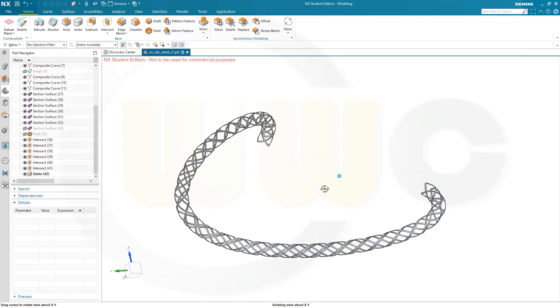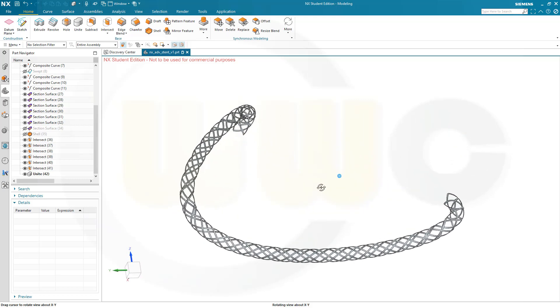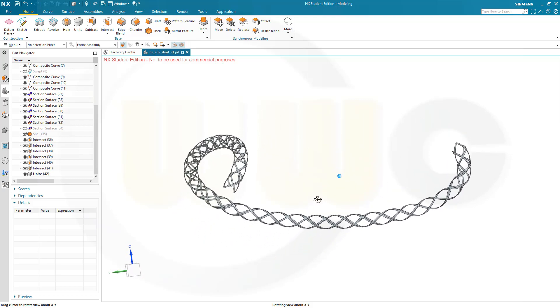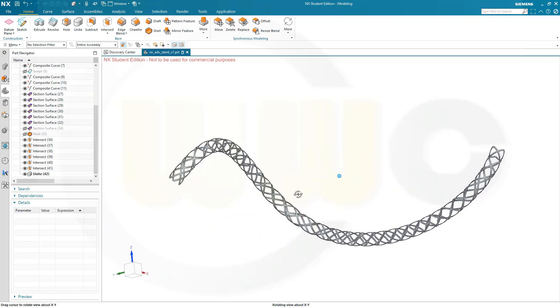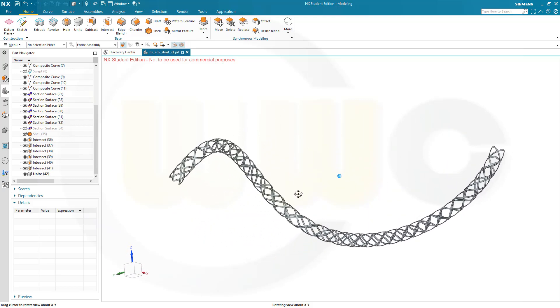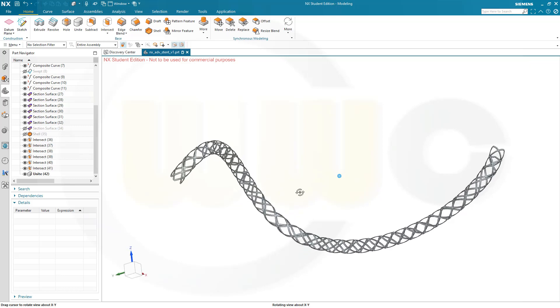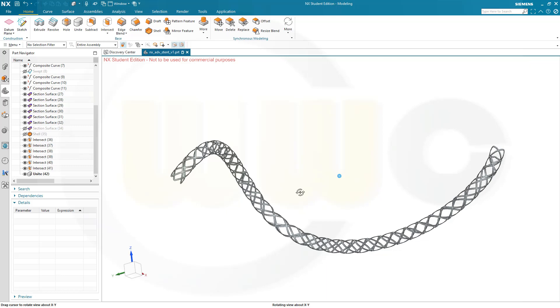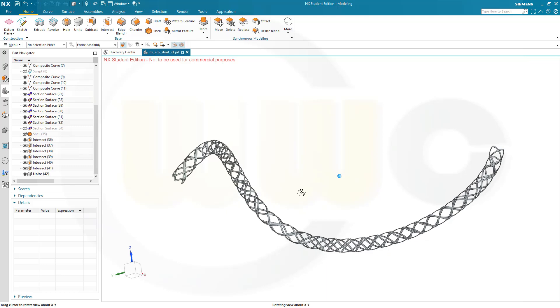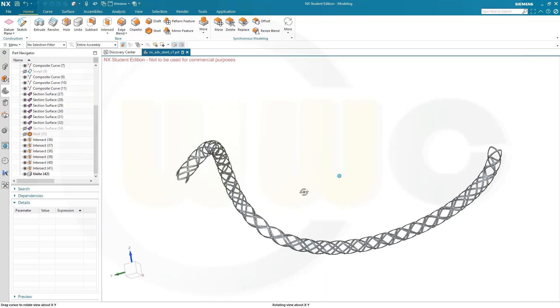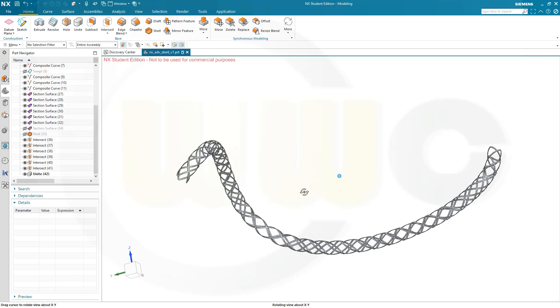This time I used section surfaces because it's more convenient to use a section surface than to create arcs and then use a sweep. So let's have fun with Siemens NX!